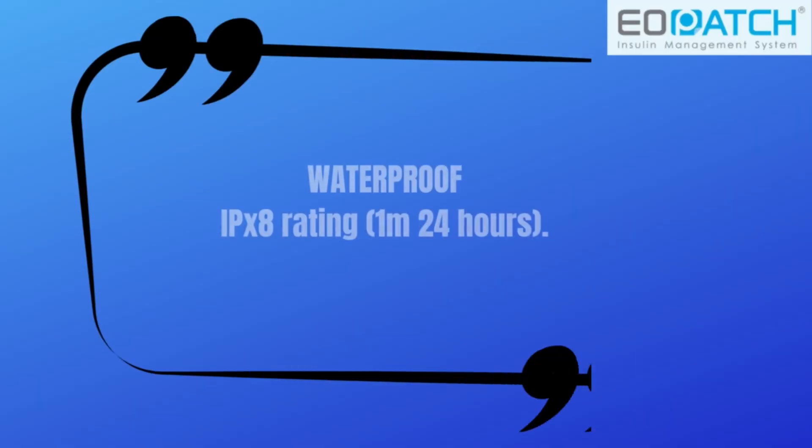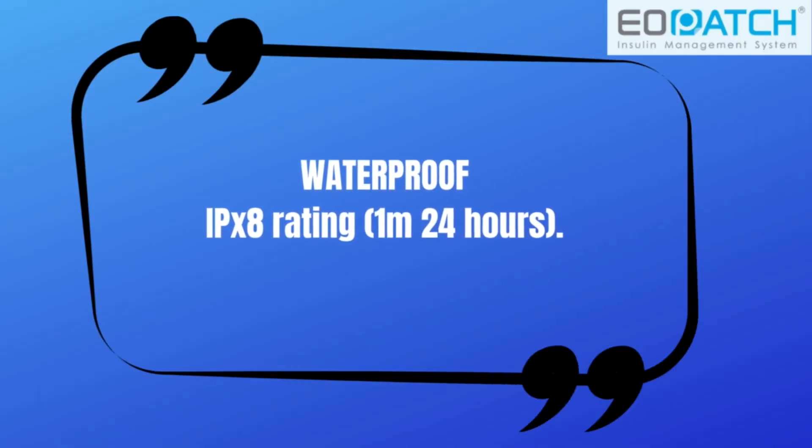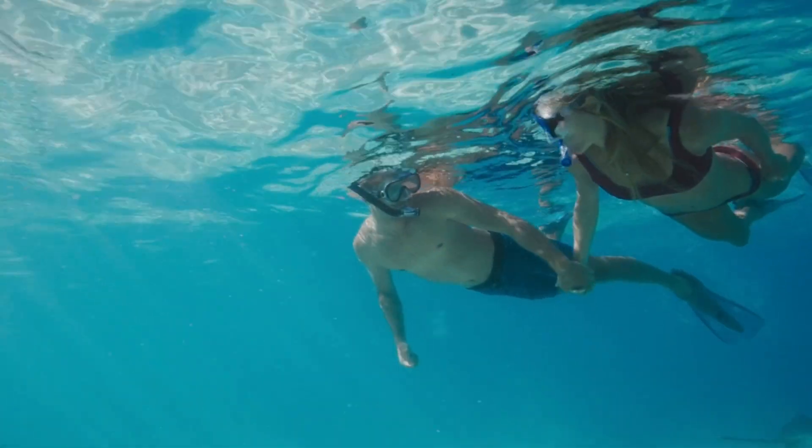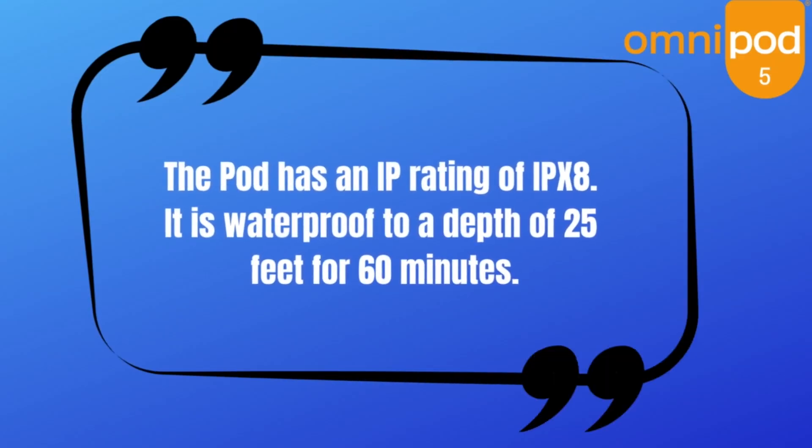Another nice upgrade for this pump, especially for those who spend a lot of time in the water, is that it has an IPX8 rating for up to 24 hours — so you can be snorkeling with this pump all day long and not have to worry. The Omnipod, by comparison, also has the same IPX8 rating, but only for up to 60 minutes.